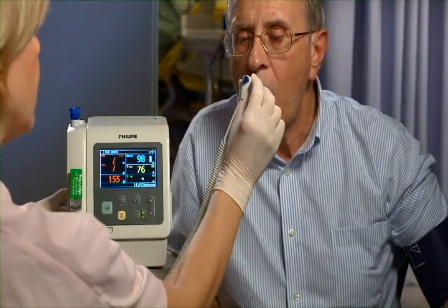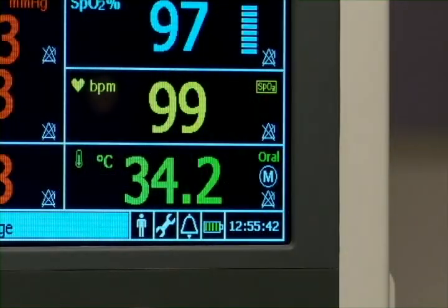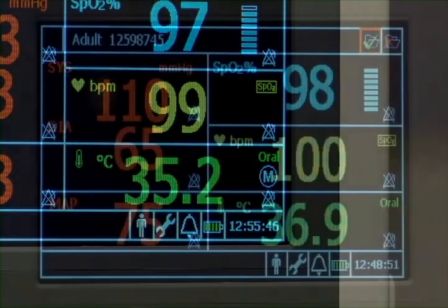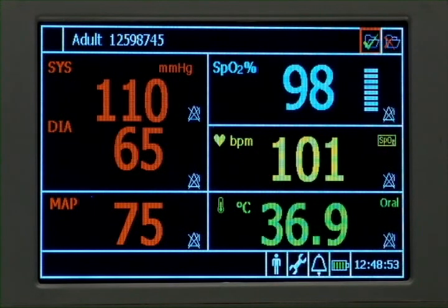The next measurement is temperature. There are two modes for temperature measurements: monitored mode, which provides a continuous measurement, and predictive mode, which takes a single measurement.